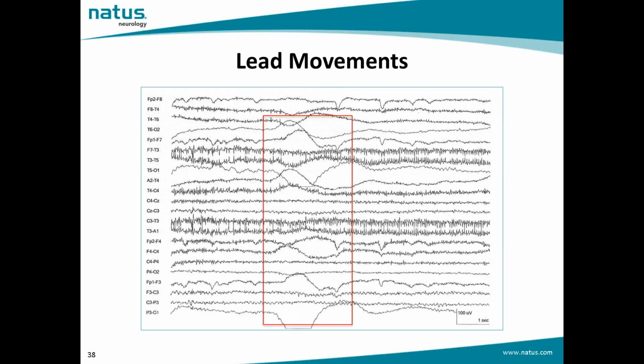Movement of the head and body or of the electrode wires can cause artifacts even if all electrodes make good mechanical and electrical contact. Some movement artifacts can be identified by their rhythmical appearance, as for example tremor, chewing, sucking, or breathing movement artifacts.